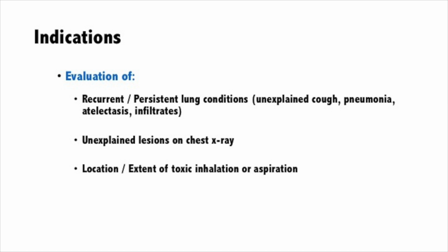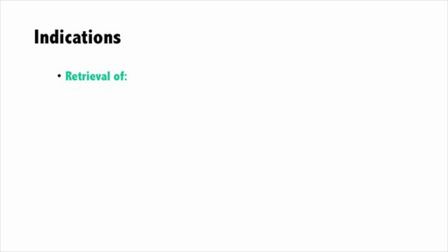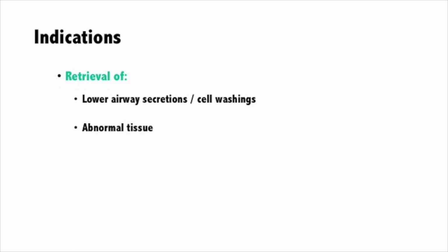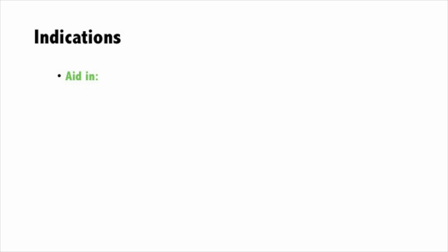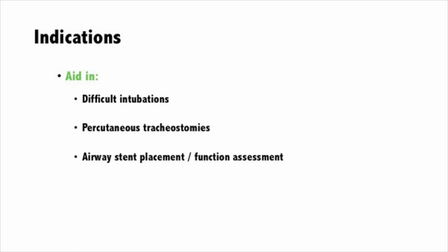The procedure is also indicated for the retrieval of lower airway secretions or cell washings, abnormal tissue, foreign objects, and mucus plugs that could be causing lobular or segmental atelectasis. And lastly, it's indicated to aid in difficult intubations, percutaneous tracheostomies, airway stent placement and function assessment, as well as airway balloon dilation of tracheobronchial stenosis.